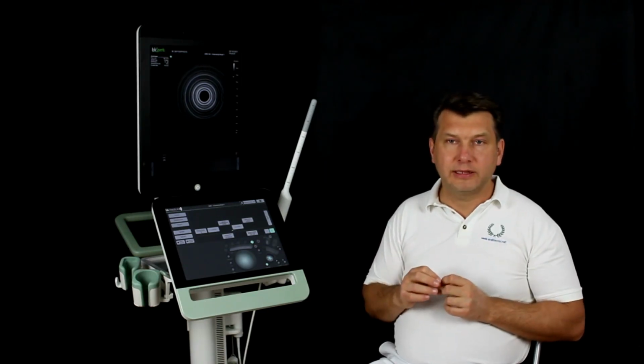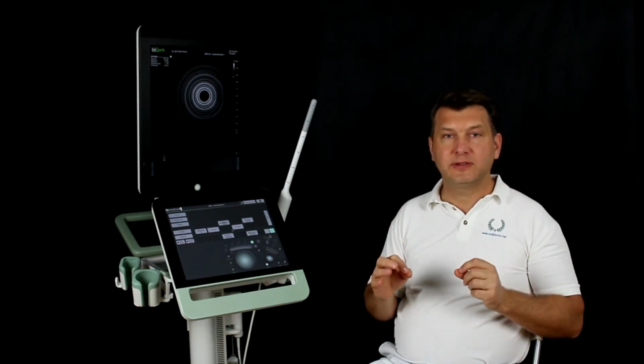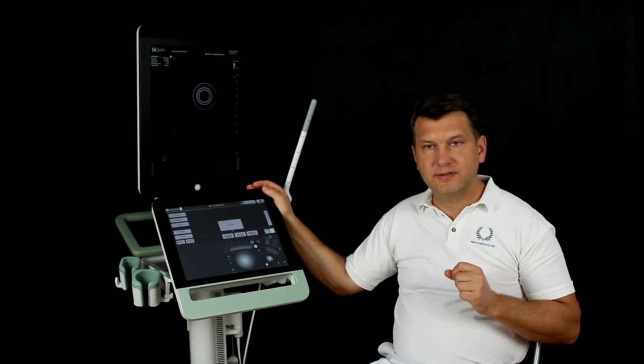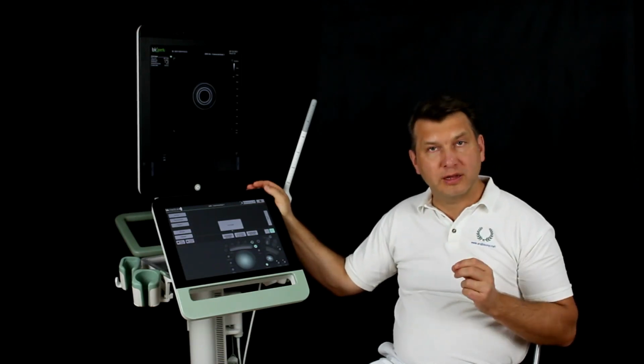When assessing the anal canal, if no disturbing factors, for example pain, are present, this distance should be chosen as low as possible. The higher the distances, the lower their recording time, but the worse the recording results.